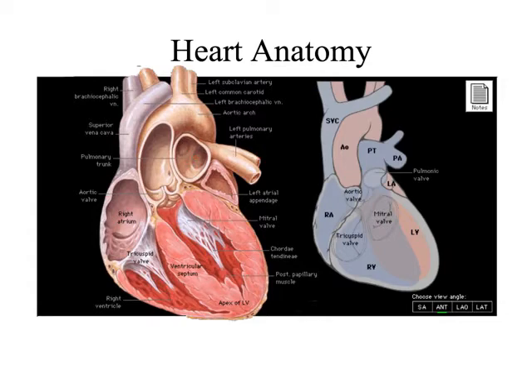One thing I want us to pay especially close attention to is right here, these three arteries up on top branching out from the arch of the aorta. We have the right brachiocephalic artery, then the left common carotid artery, and then the left subclavian artery. The reason this is significant on the CT images, if you can imagine, this is the brachiocephalic artery coming over.